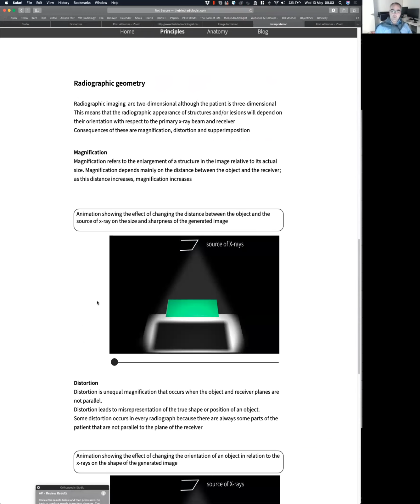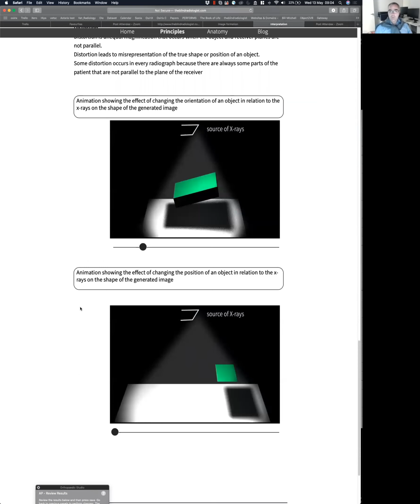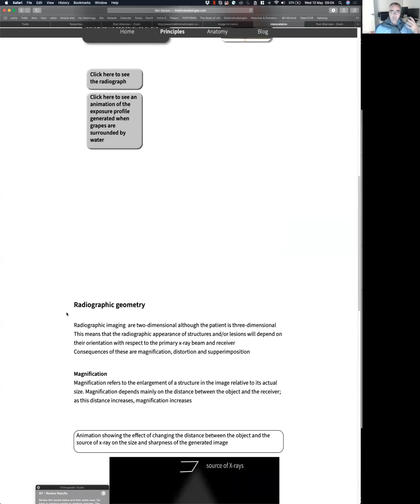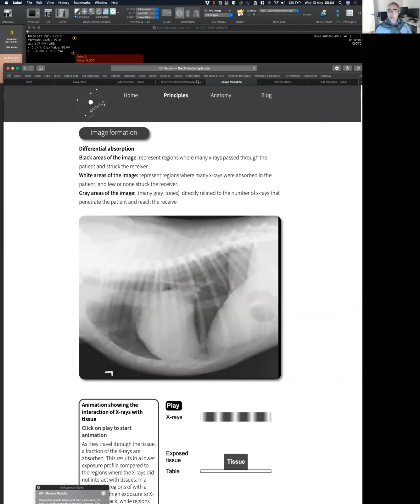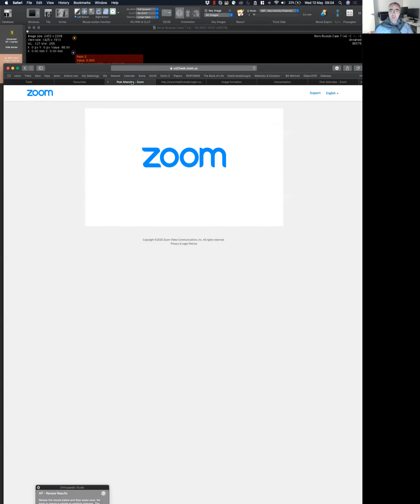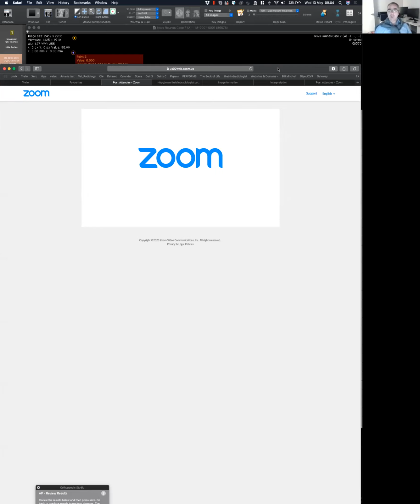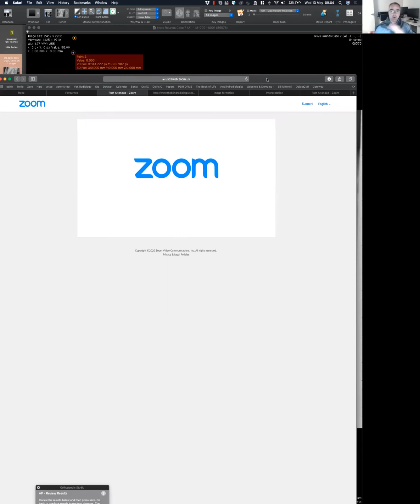We are going to come back to what magnification means, and I created this little video or animation to make the principle very simple. I anticipate that we will come back to these principles many, many times, so going back to this website to grasp the basic idea may be a good thing. It's free. The name is The Blind Radiologist, and I put the link here on the blog. If you just type The Blind Radiologist, you will get it anyway. In addition to the books, it is a good place to go back to the principles. I made a big effort to make it simple with animations, bringing the principles into a very simple little story.